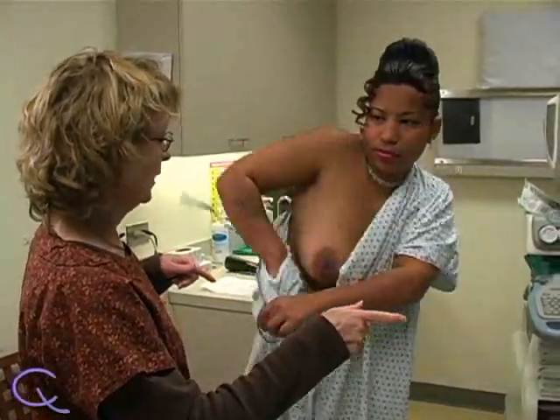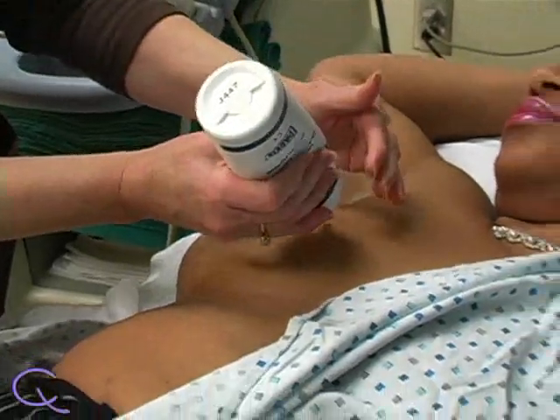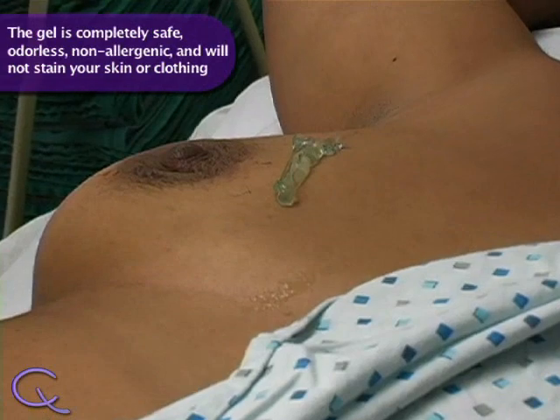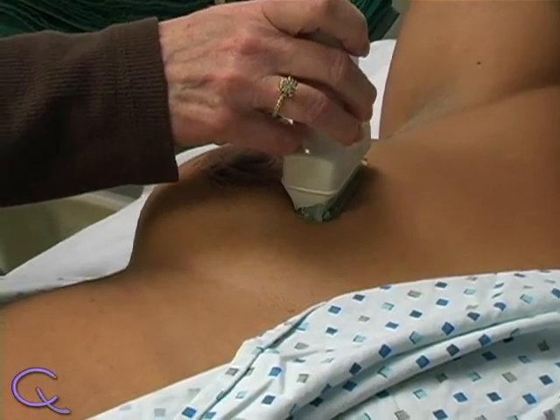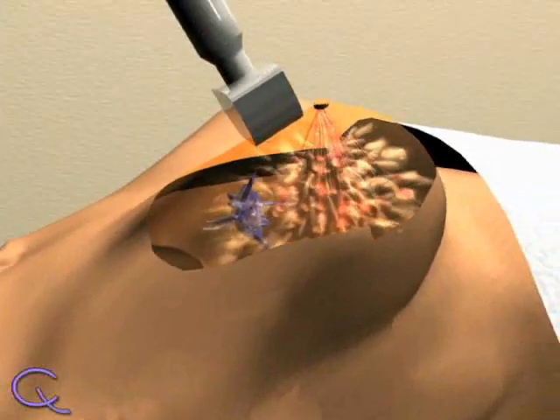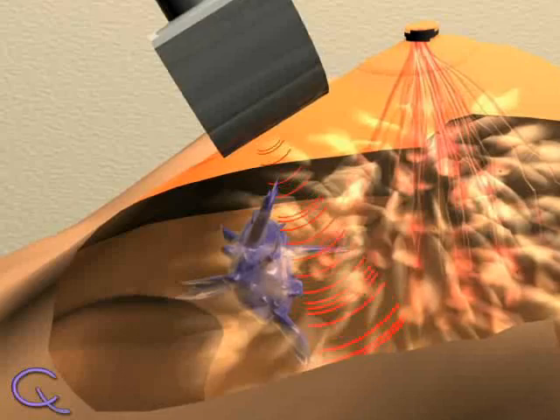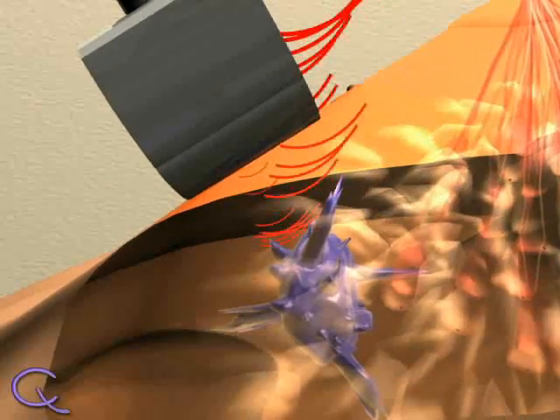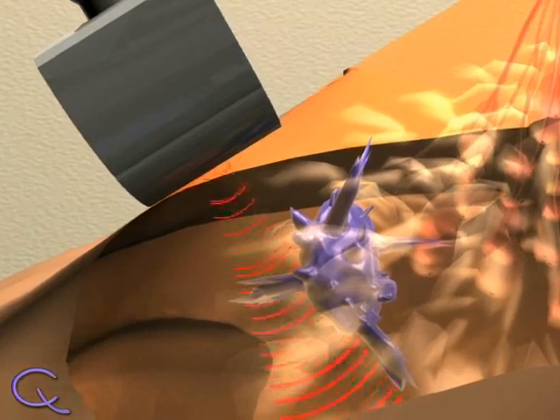You will then be asked to lie down on the exam table, and a gel will be applied to the skin above the area to be imaged. The gel increases the amount of signal from the transducer that penetrates the surface of the skin, thereby producing the best possible image. The technologist will then press the transducer firmly against your skin and move it over the area of interest. The transducer emits sound waves that travel through the body and reflect off of internal structures, collecting reflected waves which, depending on the characteristics of the tissue encountered, bounce off in different ways. The ultrasound unit then processes the reflected waves and produces an image that shows the type and location of structures in that area.